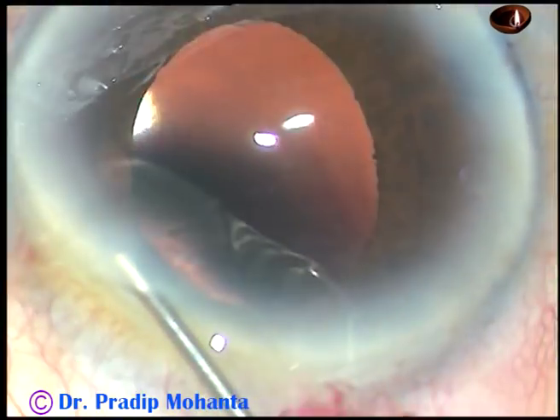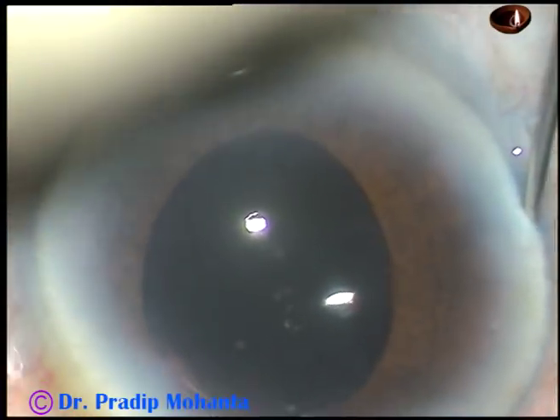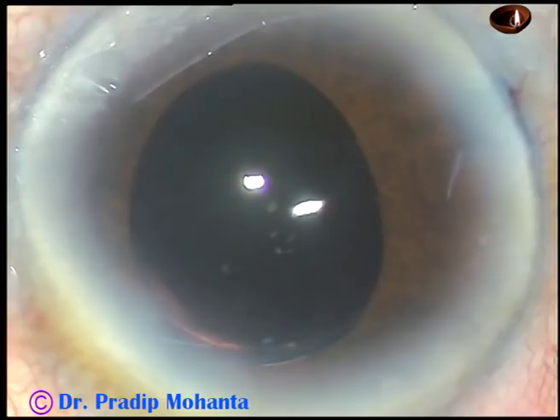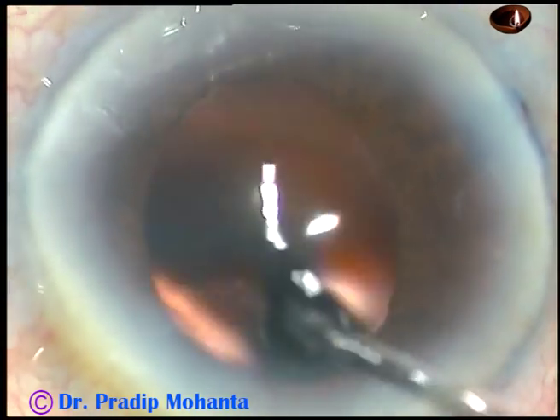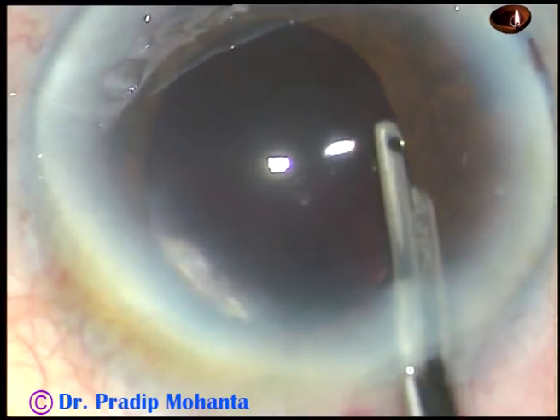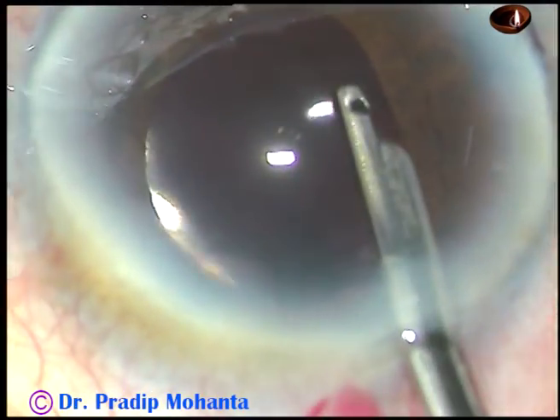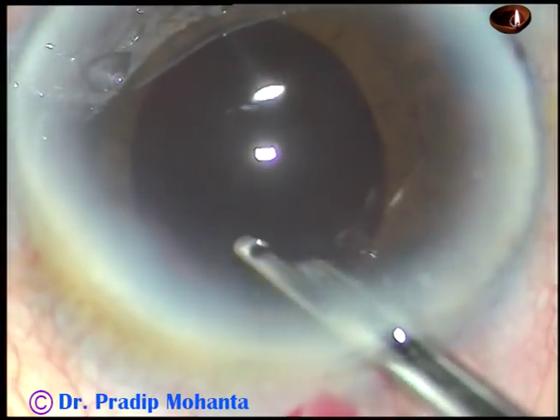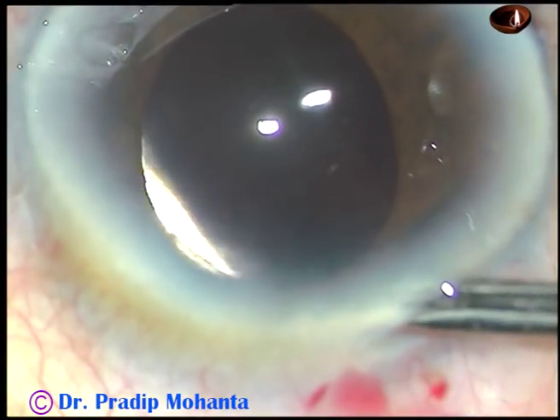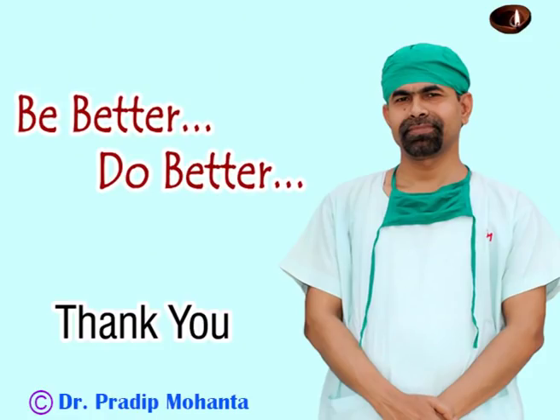Now the stroma is hydrated at the stab wounds, which closes the wounds and makes them watertight. This is the final lavage of the anterior chamber — the case is done. We just have to form the anterior chamber and conclude. See the main wound — there is no wound burn. This is the beauty of Oertli. Thank you very much for watching; I hope this video will help you in developing your surgical skills. Be a great surgeon and do great service to mankind.